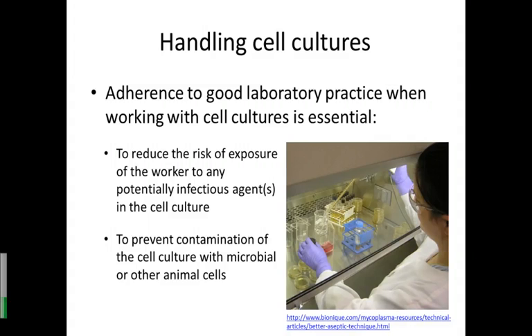In order to handle the cell cultures, you will need to adhere to good laboratory practice in the lab. For example, the personnel will need to wear protective clothing, gloves, and goggles, and practice the set of aseptic skills which is required to culture the cells. So why do we need to practice this aseptic technique?